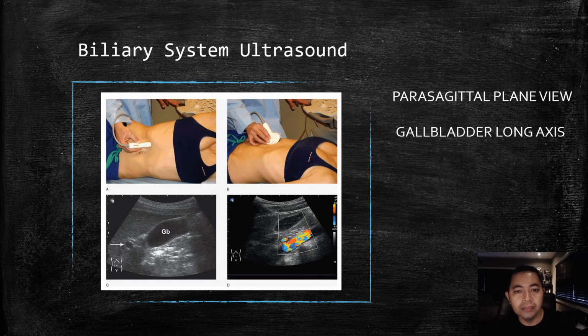A lot of the biliary system can be evaluated with sonography. The gallbladder and extrahepatic bile ducts are easily seen in transabdominal ultrasound. The intrahepatic ducts are, however, usually too small to be seen if they are not dilated.